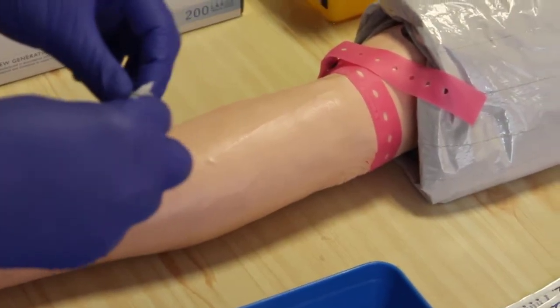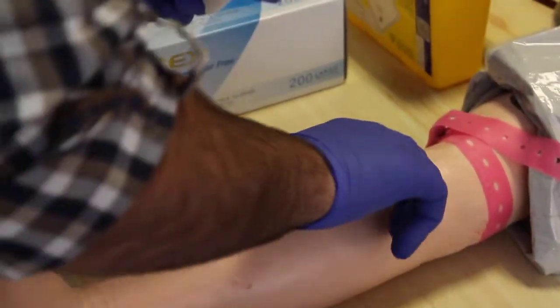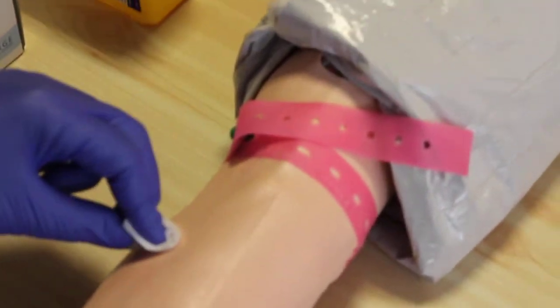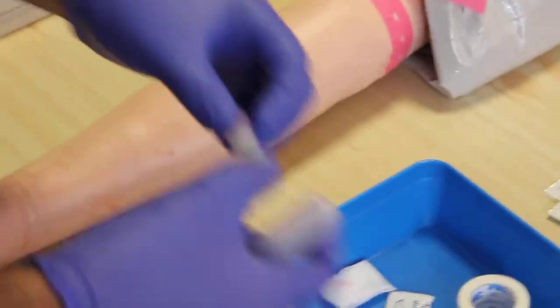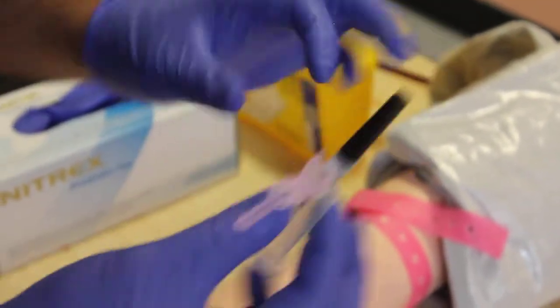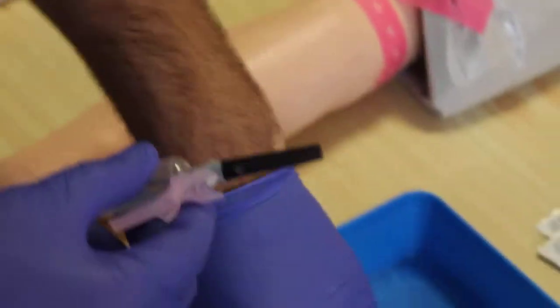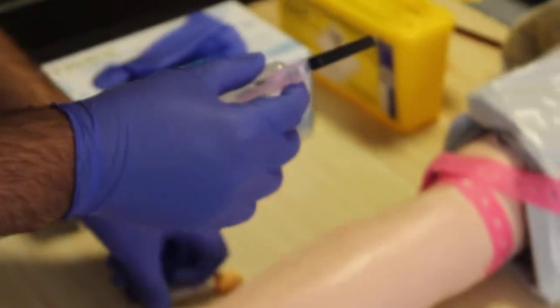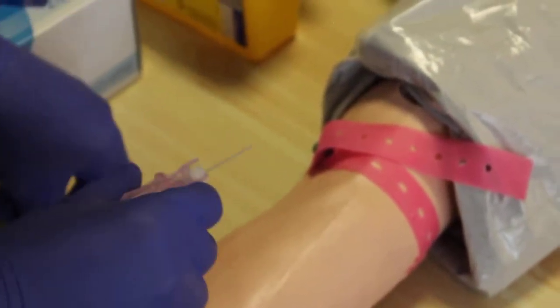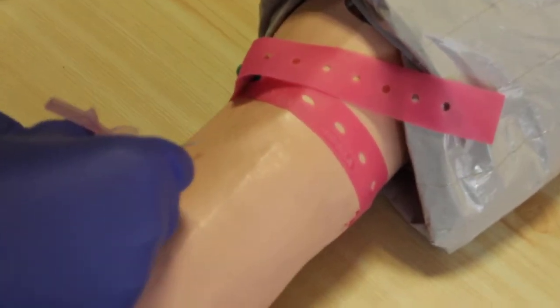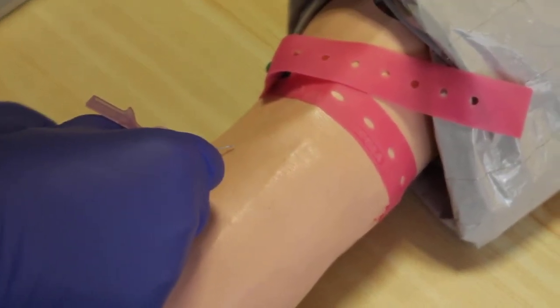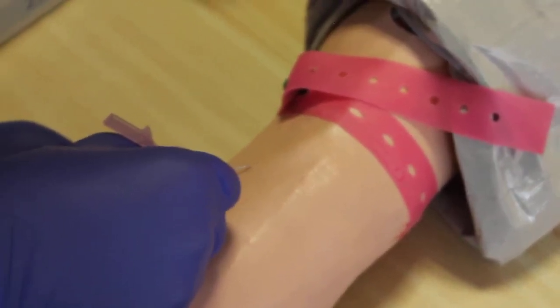Take the alcohol swab, palpate the vein, and clean it with the swab. Take the needle. Do not touch the part you've already cleaned. Let the patient know of a sharp scratch before you go in. Sharp scratch.